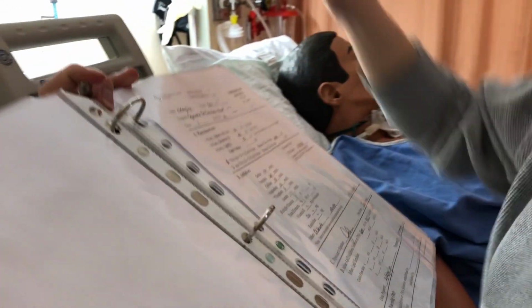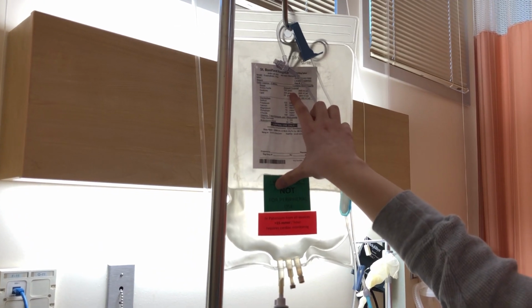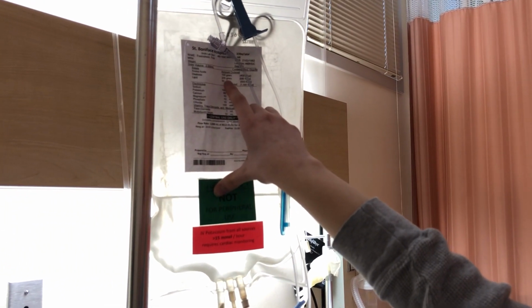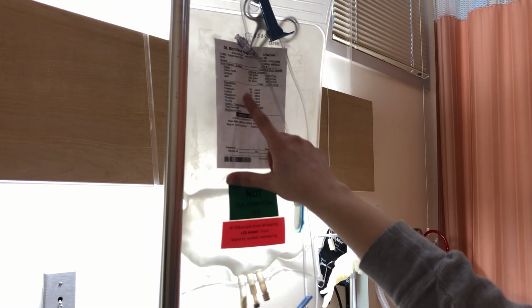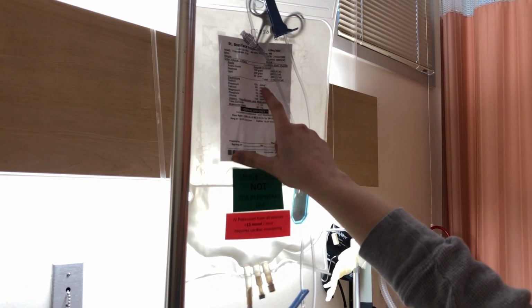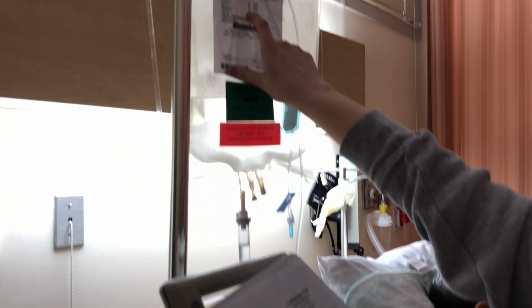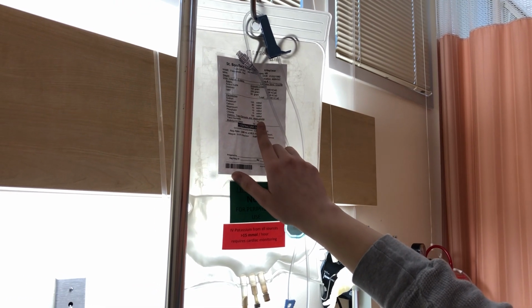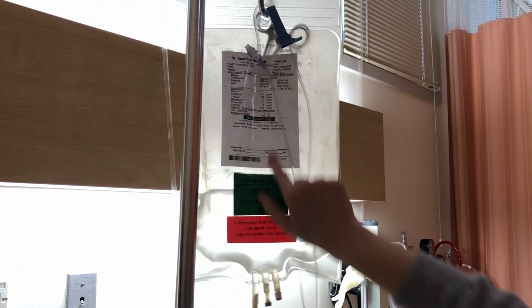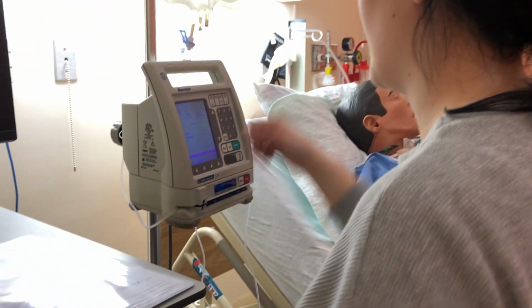I'm just going to take my requisition and make sure that that matches up as well. So amino acids, 100 grams, that's right. Dextrose, 200 grams, that's right. Lipids, 50 grams. Okay, that's good. Sodium, I have 120 millimoles. Potassium, 60. Calcium, I have 10 millimoles, that's right. Magnesium, 10, that's right. Phosphate, 15. And chloride 158. So that matches up, and it's a 2,000 ml bag, so that matches up. Okay, so I have my first check done.